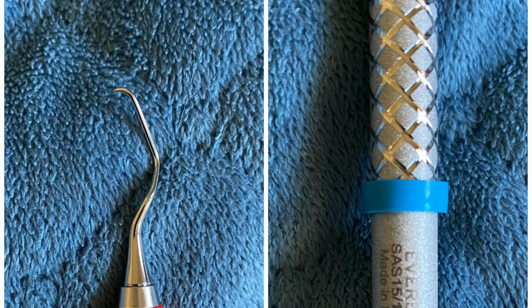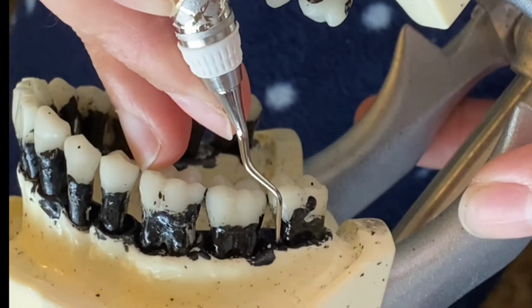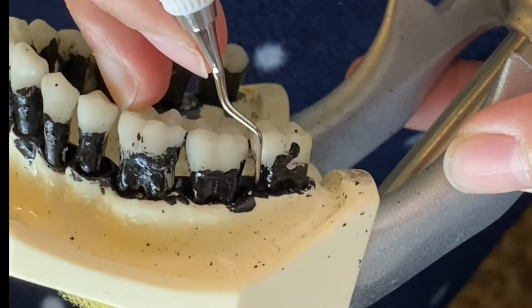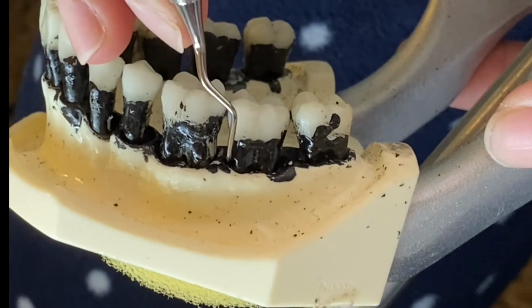To finish off this quadrant, we'll be using the 15/16 Mini Gracies. This instrument is similar to the 17/18 Mini Gracies, except that this one is meant for mesial surfaces of the posterior teeth. Again, I'll have my patient face slightly towards me, and I'll be sitting at 10 to 11 o'clock to be working with the lower left quadrant. As you can see, I'm starting on the mesial surfaces, and I'm starting at the base of the pocket. Then I'm bringing it up towards the CEJ using short strokes.